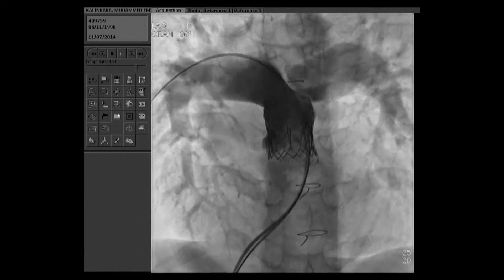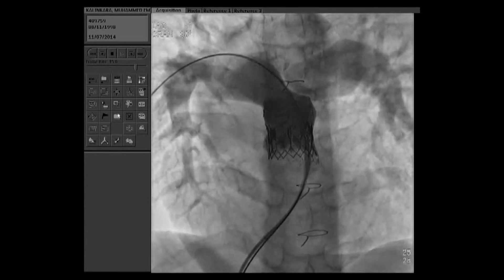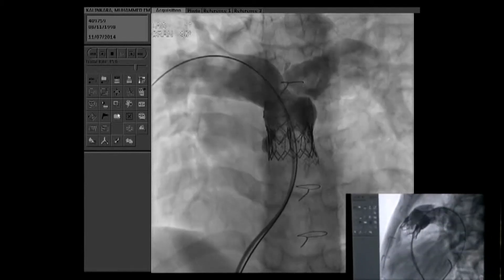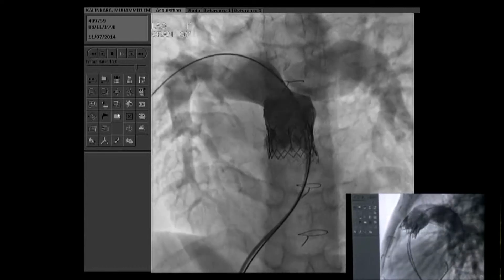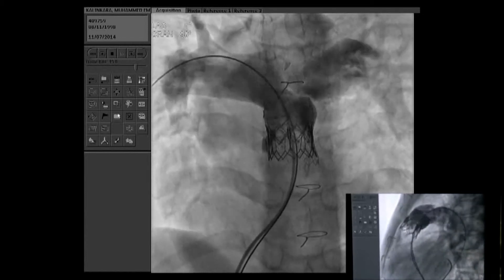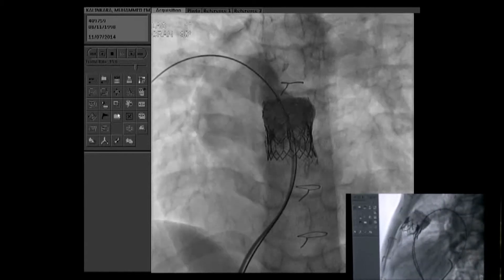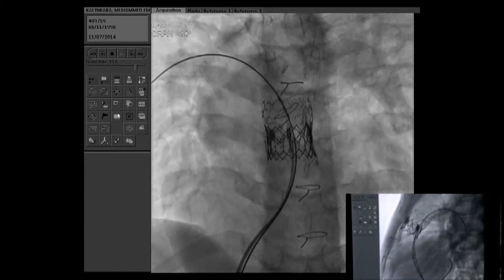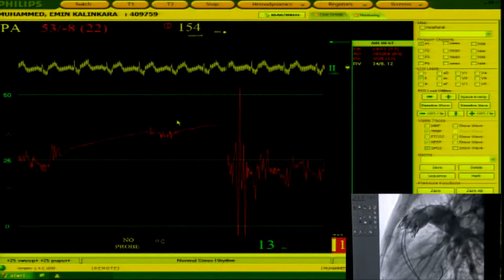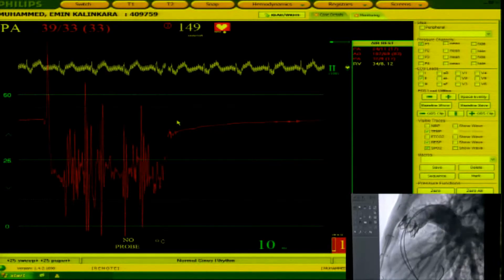But there is no regurgitation at all. But eventually, if you want, I'd like to have a final proper injection. I would suggest — Shaq, what do you think? Is this paravalvular or just catheter-induced? I think this is catheter-induced, because the holes are a bit close to the valve leaflets. Let's see the pressure, and then do another injection. Just advance the pigtail catheter, remove the wire, and do a final proper injection with a pigtail in the main PA if you like.